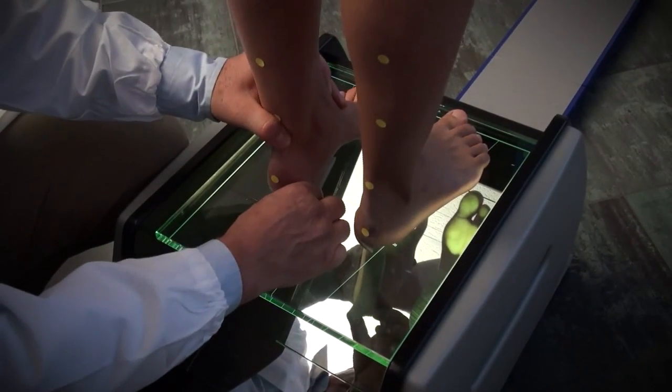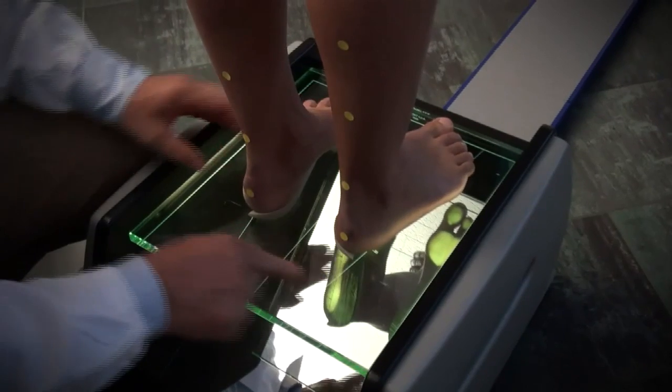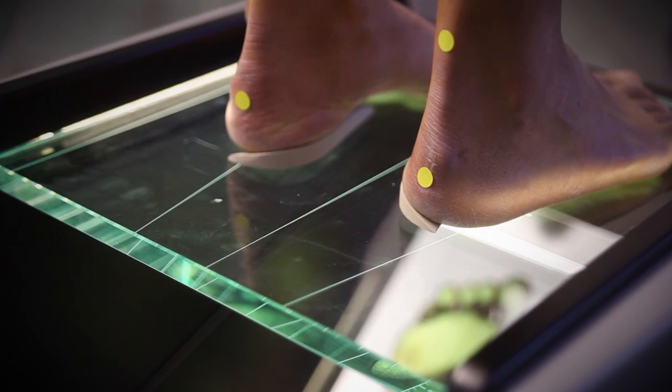By adding shims or inner soles under the foot, we obtain a clear rectification of the varus or valgus of the back of the foot.